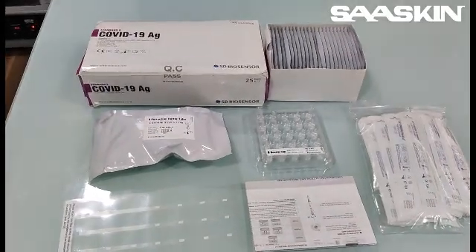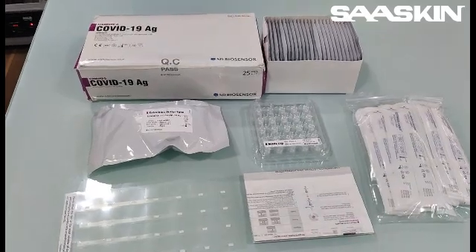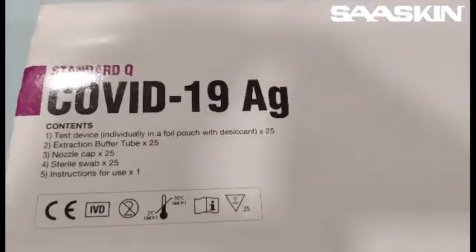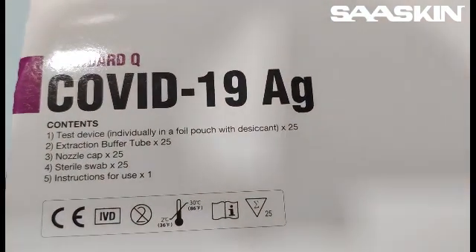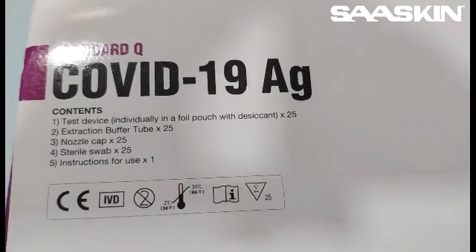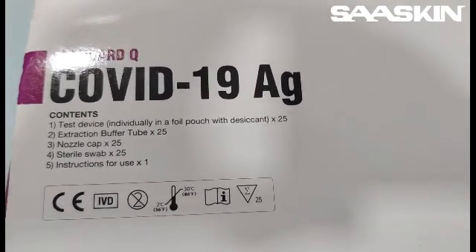Just a quick introduction about the standard COVID-SD biosensor antigen test kit. This is how the box looks like and you can see the standard contents, which is the test cassettes 25 numbers, extraction buffer tube 25 numbers, nozzle cap 25 numbers, sterile swap 25 numbers, and the instructions for use.